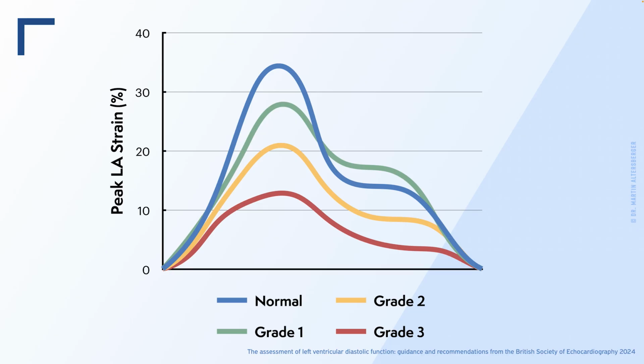For me personally, I do think the probably best cutoff for a significantly diseased left atrium is in the range of a left atrial strain of 20%. So below 10% is devastating. So the left atrium might be entirely fibrotic because of such a low strain value that shows that this atrium significantly took damage by means of, for example, filling pressures. If it's above 30, the left atrial strain, the reservoir phase, you can be very sure that it is normal.